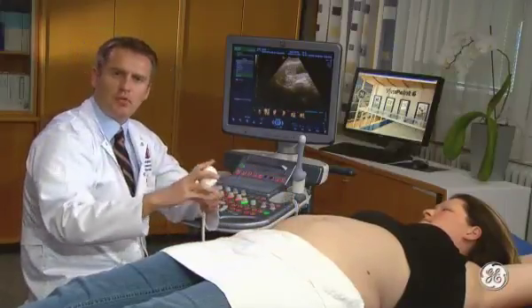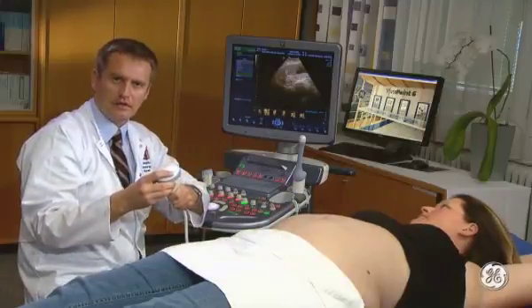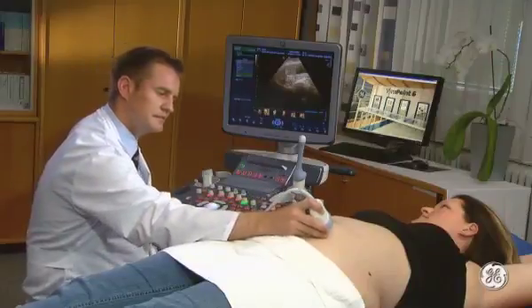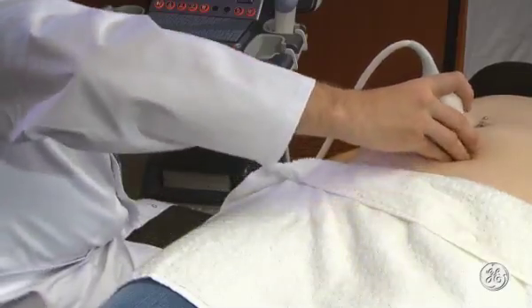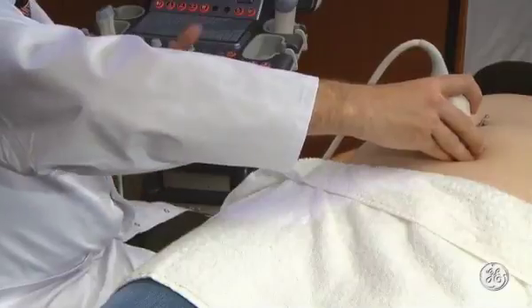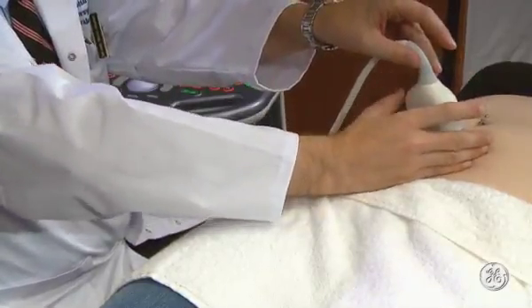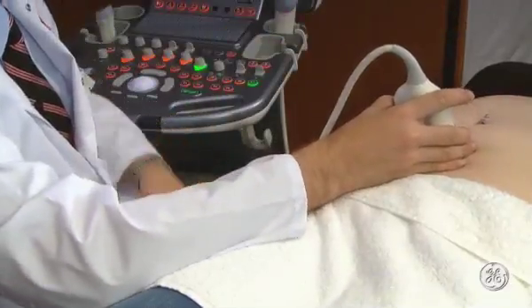The proper way of holding and moving the transducer is of major importance. One should avoid working with a volume probe without stable support. You can use the hand for support, the forearm, or the elbow.